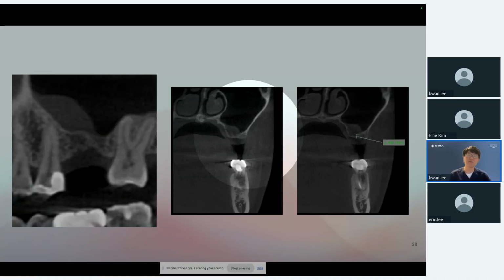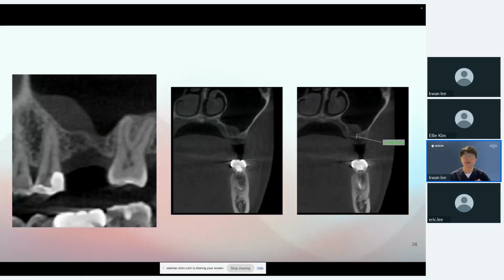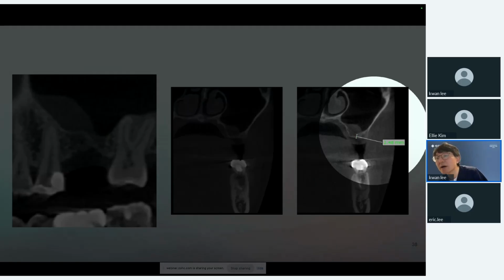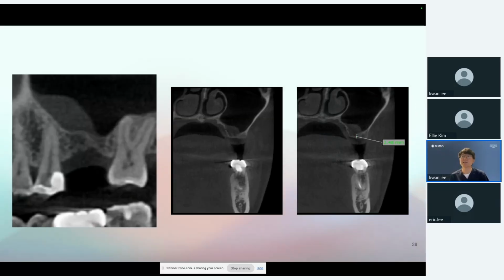There are other factors which I'm going to go over in my actual courses, but the number one key component would be just like doing a root canal. When you're doing the root canal, you want to find out the working length. Same thing when you're doing sinus elevations, you want to find out how much residual bone height you have. The CBCT tells about 2.48 of residual bone height. So what do you know about 2.4? Let's say round it down to 2.